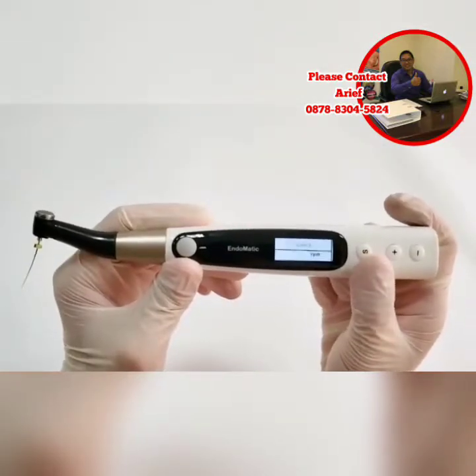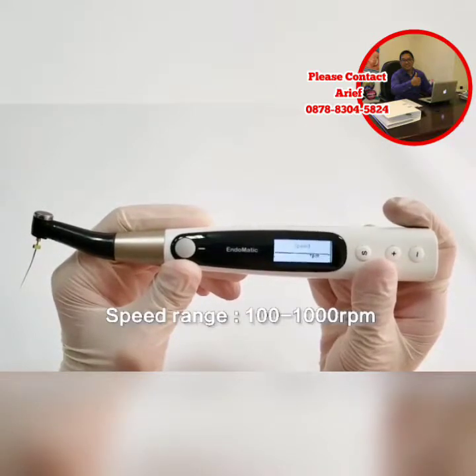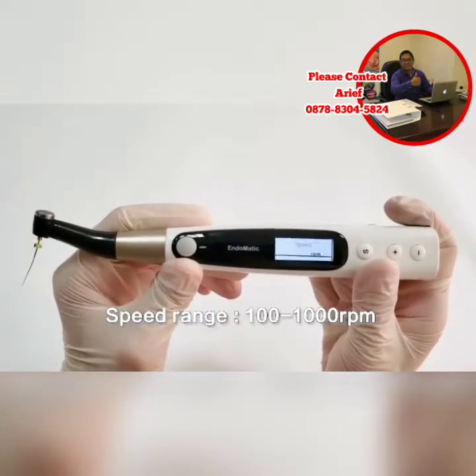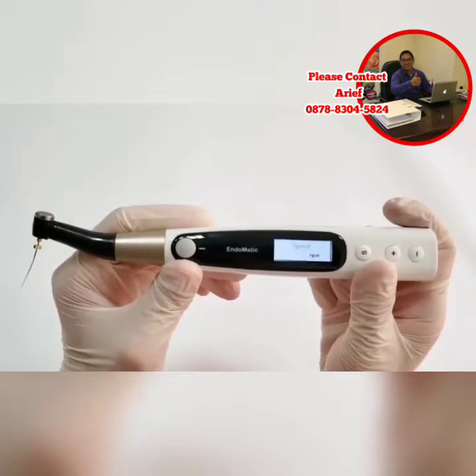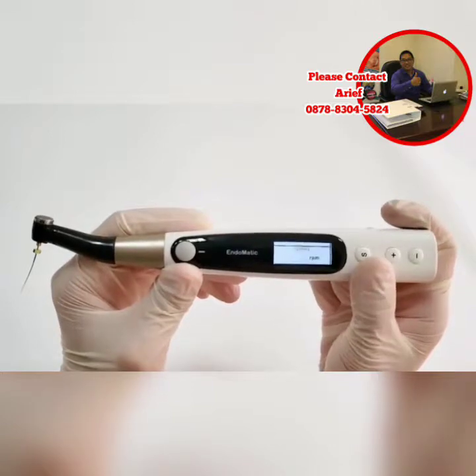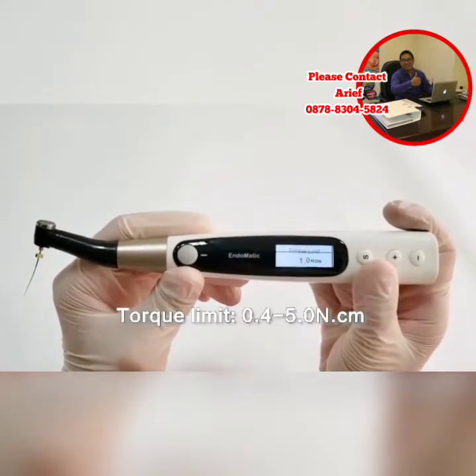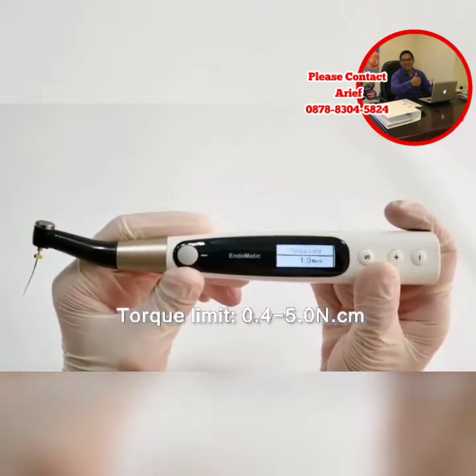Press the S button again and we will see speed mode. The speed range is between 100 to 1000 rpm, so high-speed files like Endosharper can be used on this device. The next mode is torque limit mode, with a torque limit range between 0.4N to 5N.